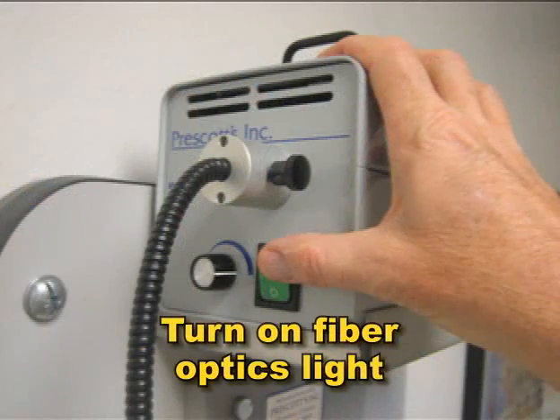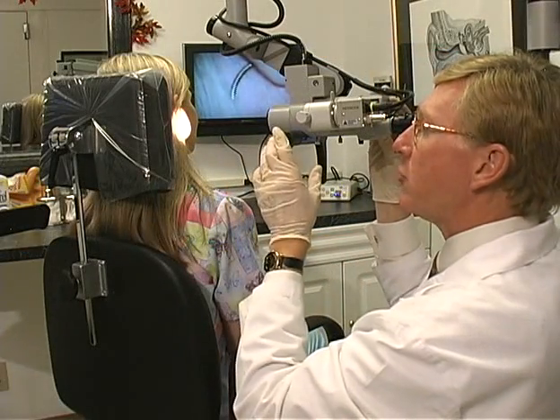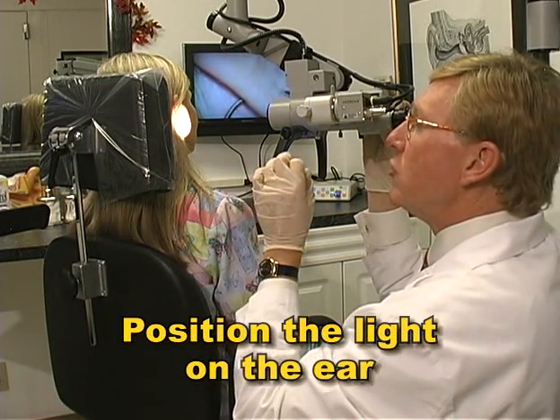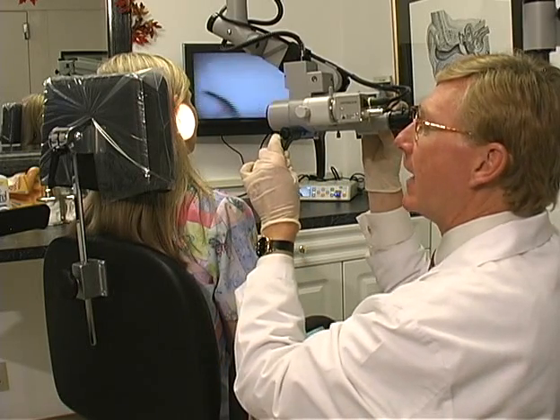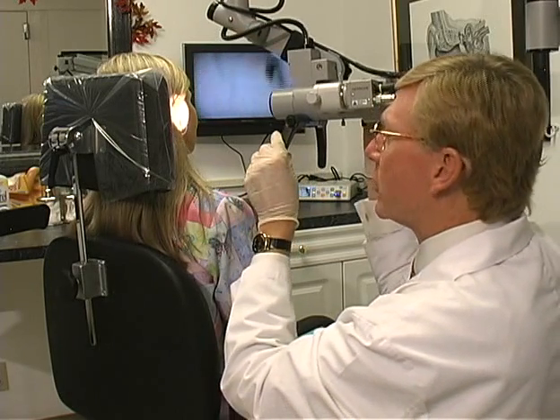Turn on the fiber optics light and adjust the amount of illumination to your preference. Then, without looking through the microscope, position the light on the patient's ear. New users tend to look through the scope while trying to find the ear, but the better way is to position the light without looking through the lens.